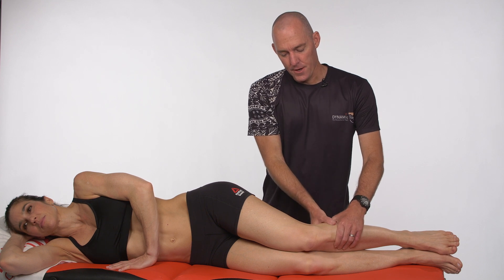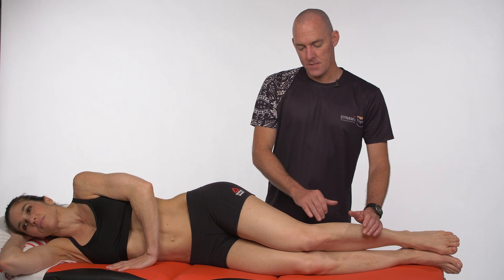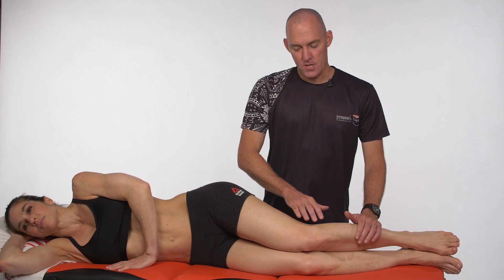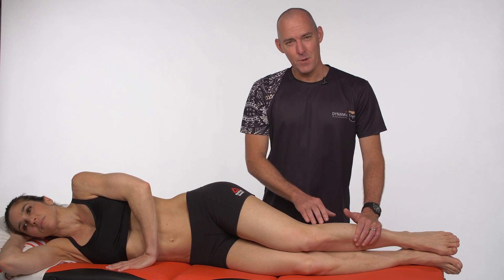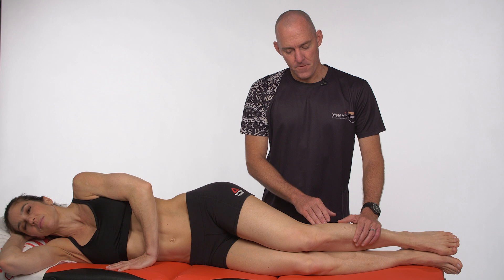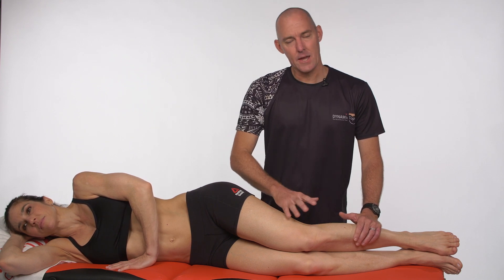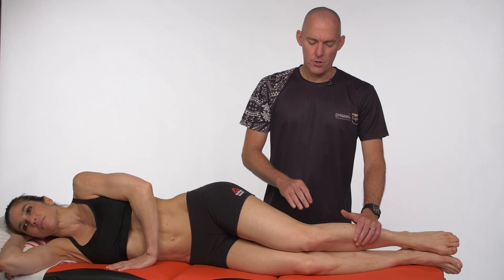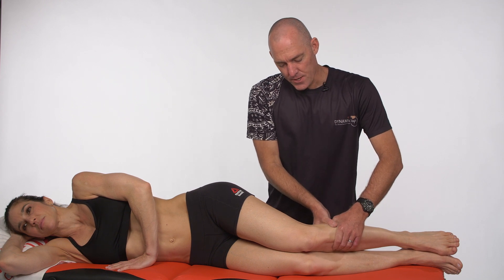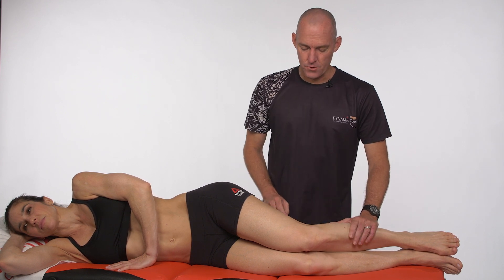We're going to spiral around the shank here initially first, but the other purpose for doing that is that there is a suggestion that some of these iliotibial band syndromes stem from some instability at the superior tib-fib joint, which leads to some excessive activity in the biceps femoris, and that can perhaps cause some irritation of the reflection of the nerve and set up almost like a neurogenic pain through there. So we're going to address that underlying factor of that instability by getting some force closure through that superior tibiofibular joint first.